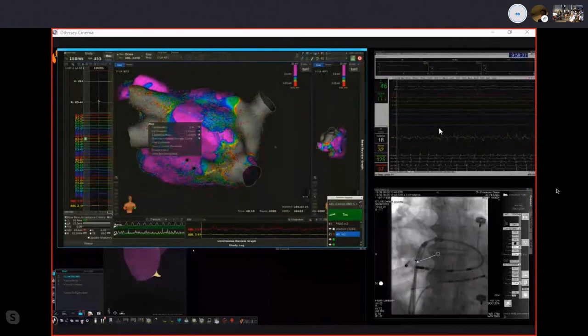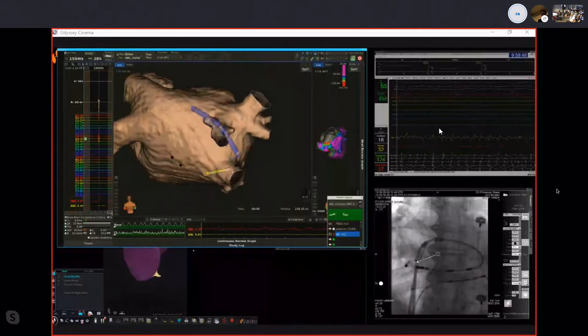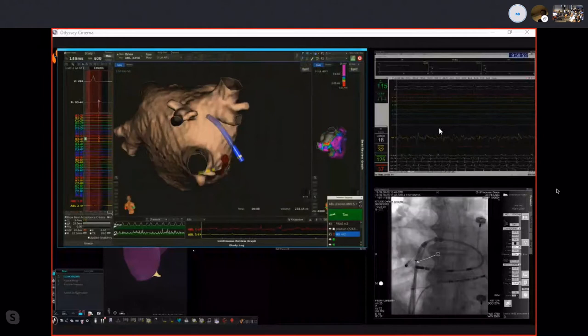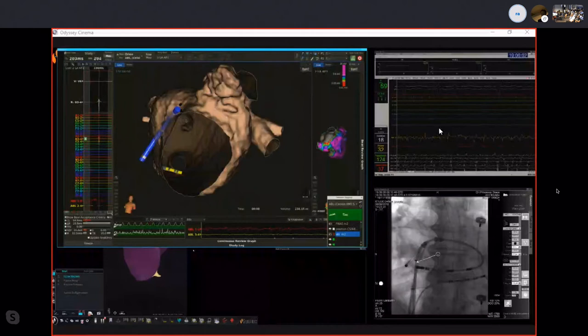And let me show you how this geometry is superimposed with the CT scan. Can you decrease, please, the transparency of the CT scan and take away the map for a few seconds? So you can see the real anatomy as it was reconstructed from the CT scan with this supplemental, let's call it middle vein in the right, and the two classical right PVs, but also the two left pulmonary veins. Okay, now let's go back to the map.